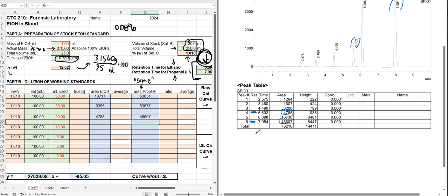Maybe they need to go back to 114 or 115 and redo those volumetric pipetting exercises and those micro pipetting exercises again and again. It could be either or. So I'm not blaming the machine totally. It could have been, but it could have also been sample prep and an analyst problem. So we'll leave that number in there for now and we'll see what happens.